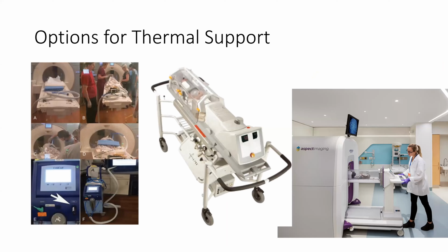There are lots of options, especially for MRI now. We've got in-unit MRIs, we've got MRI incubators, and even taking our cooling devices, which can then be used as warming devices while we take them to the MRI suite. And we have these very long extension tubings that can stay out at the console and keep you safe. And I know Tim's going to talk about that.